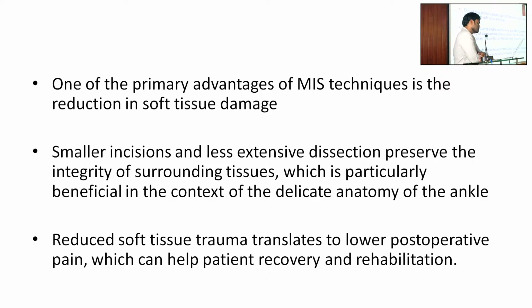A low profile plate, and wait for the wrinkle sign to appear, and it also prevents the flexion. Yes, because we are trying to stretch the soft tissues which are crumpled. Then at the end of 3 weeks, we will have to do a definitive fixation by removing the fixator.